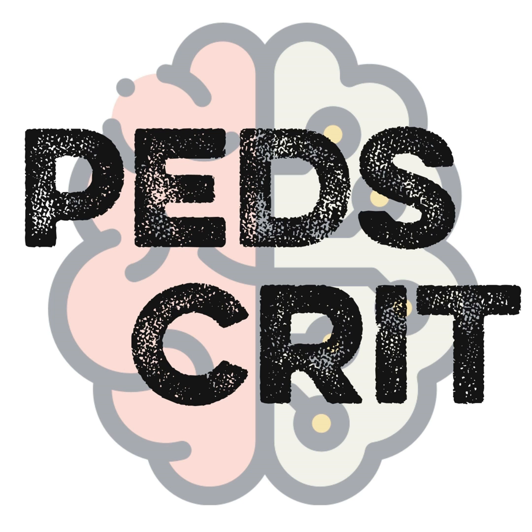Other things you could do, depending on what your tidal volume of release is, you could try to increase that. So if your release volumes are like 5 per kilo, you could do things to try to increase that volume. So you could go up on your P high to increase that volume. You could also potentially go down on your P low or stretch your T low out. Again, though, if you start manipulating those things, you really have to be careful about your expiratory lung volumes to make sure that you're not losing ground and creating atelectasis and losing your lung recruitment during that.